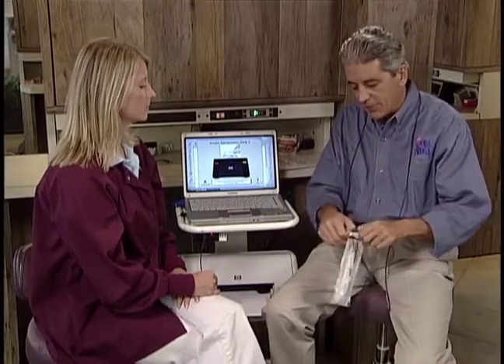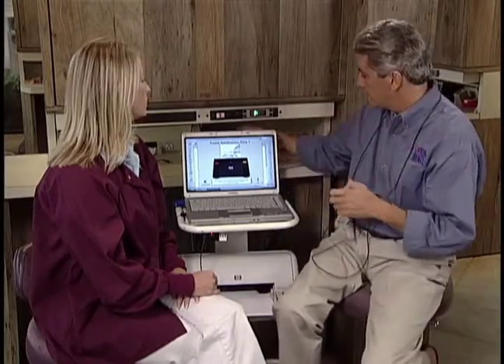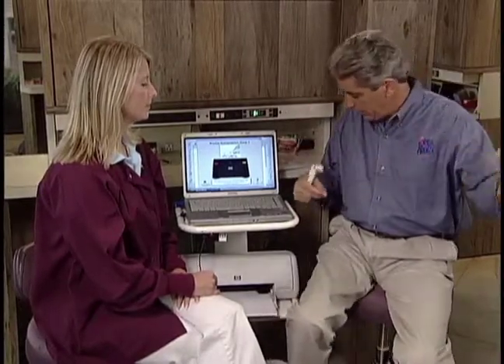So at this point I can glove up, take my handpiece out of the sterile pouch, and install the handpiece on the encoder cable. This encoder cable, think of it as the magic of the system. This is the cable that you want to protect. This is what gives us the 15 grams constant force pressure. This is what is taking the measurement. It's analogous to an X-ray sensor. I want to protect and not damage this cable, especially in the wheels of my chair.